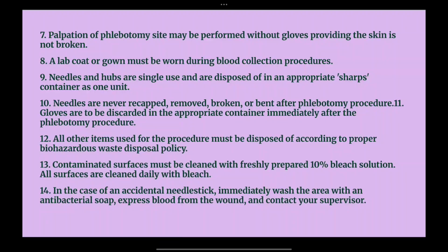Without gloves is not recommended for broken skin. A lab coat or a gown must be worn during a blood collection procedure to maintain professionalism. A lab coat or gown is going to essentially indicate that you are a lab professional and a phlebotomist. So it is essential to wear a lab coat or gown and to maintain professionalism.